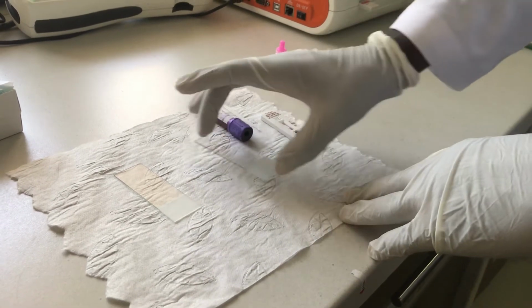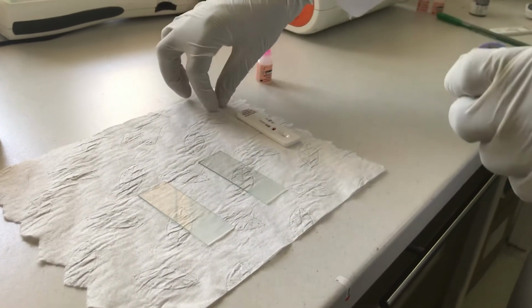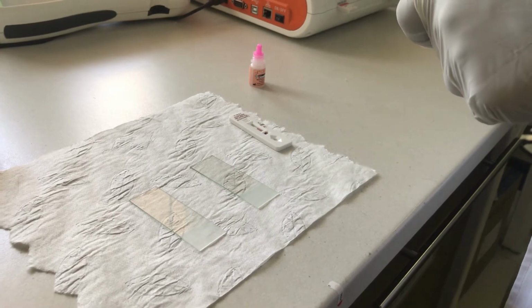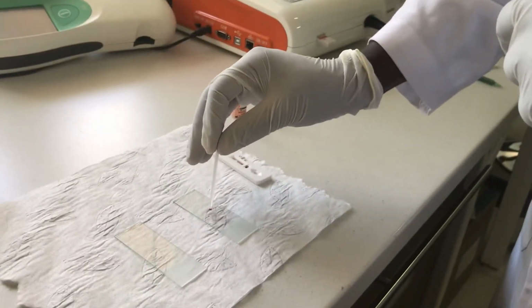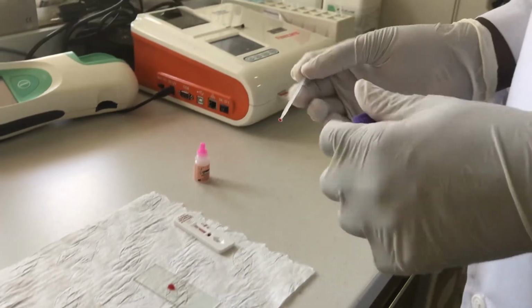For the smear, you can make a thick smear. A thick smear takes quite a large amount of blood compared to a thin smear, mainly because you want to concentrate parasites, the Plasmodium parasites.